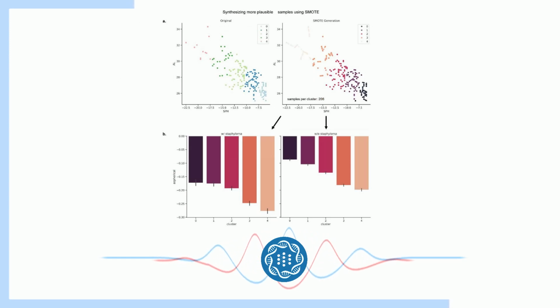Let's go back to counterfactual generation for a moment. I'm still wrapping my head around those possibilities for personalized treatment. Sure. Let's say you have a patient with progressive myopia, meaning their nearsightedness is getting worse over time. Right now, doctors basically use their best judgment and general guidelines to recommend treatments like special contact lenses or even surgery, right? Exactly. And those treatments aren't equally effective for everyone.